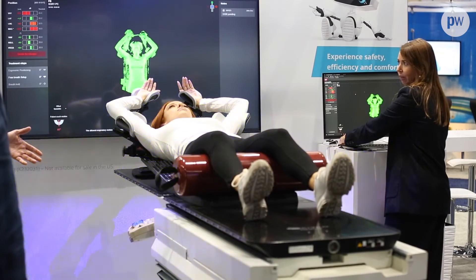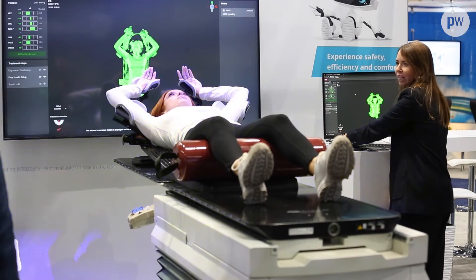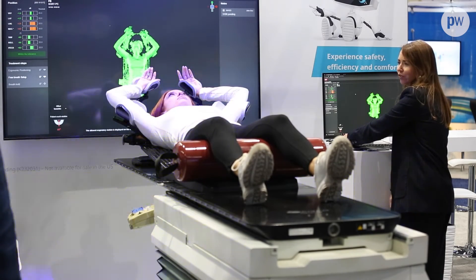A key feature of the Luna 3D is the expanded field of view, which allows clinicians to set up the patient at a lower loading position — which is much more convenient and ergonomic for the therapist.